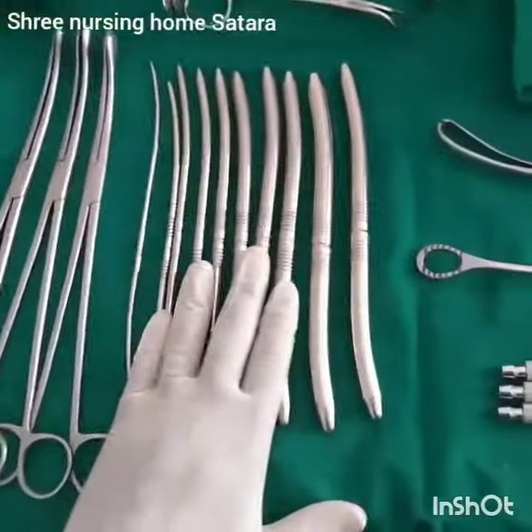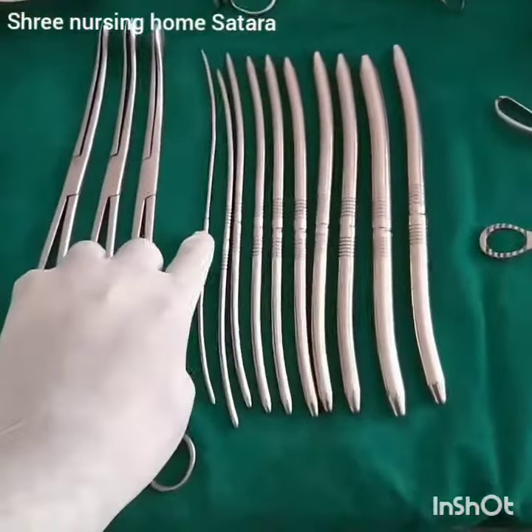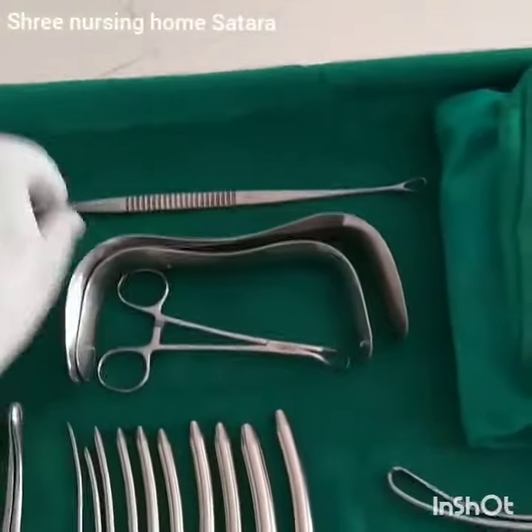Next one is dilators. We use commonly Hegar's Dilator, which starts from number 3.5 to 10.5. The next one is SIM Speculum of two different sizes.